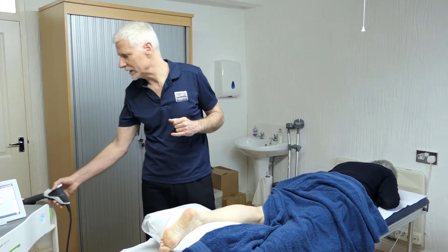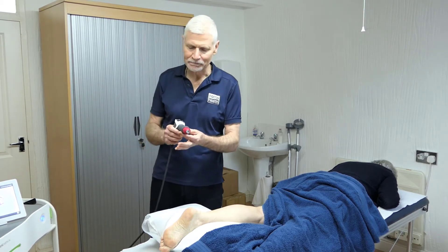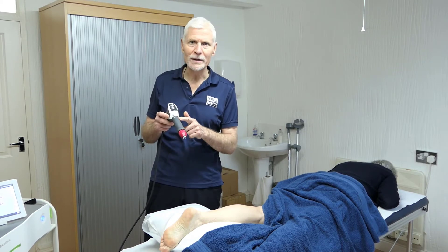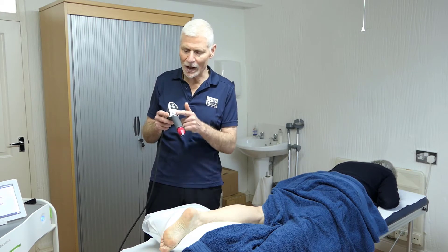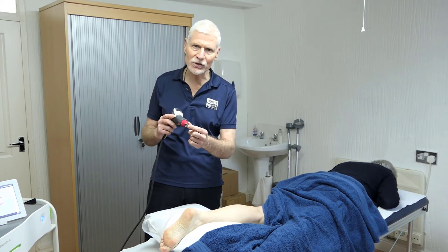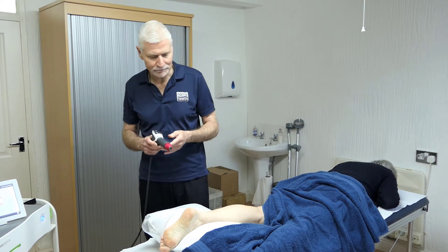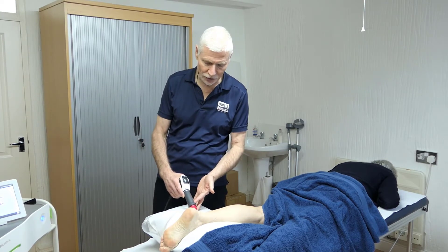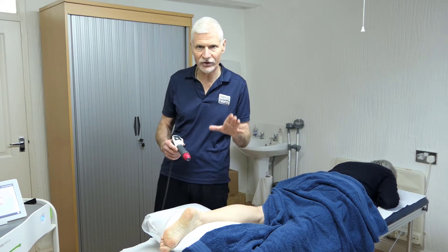This is the shockwave machine, and on the end we have our shockwave head. Essentially this is a little bit like a gun in that you have a hollow tube with a metal bullet in here, and this goes up and down. As it does so, it strikes the end of the unit, and that produces the shockwave energy. It couples onto the body, and as I place that onto the skin, the shockwave will go through the skin and into the patient's tissues.